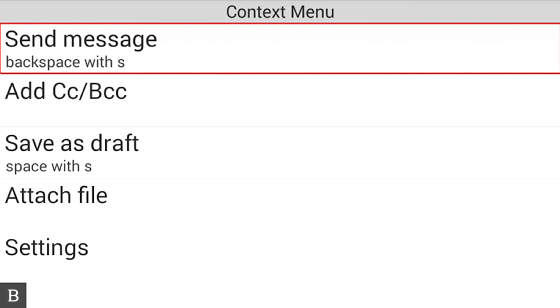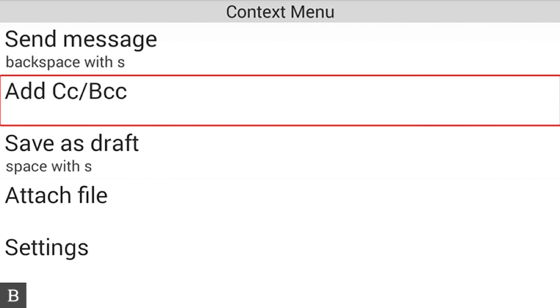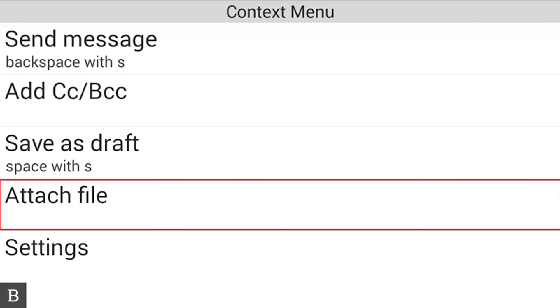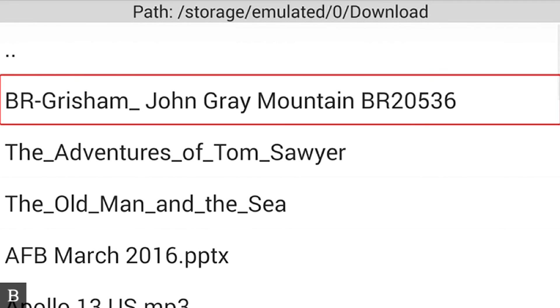What's nice about the context menu is it also shows the shortcut for each function. I can see Send Message (Backspace+S), Add CC/BCC, Save as Draft (Space+S), and Attach File. I'm going to navigate to Attach File — I could have pressed A to jump directly to it — and activate it with my cursor router key.